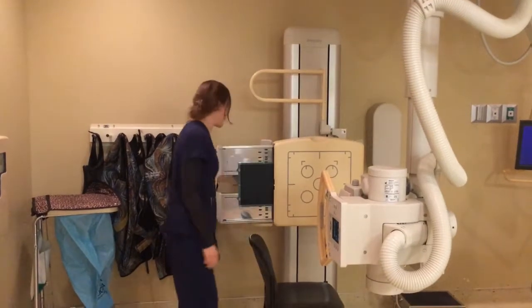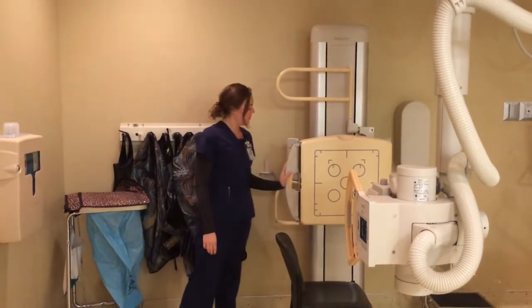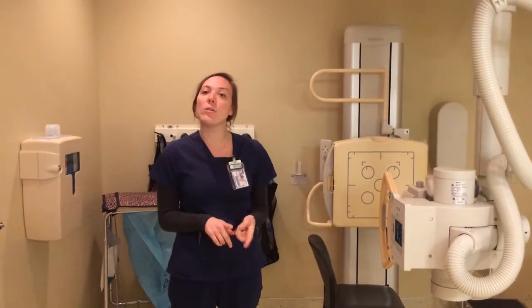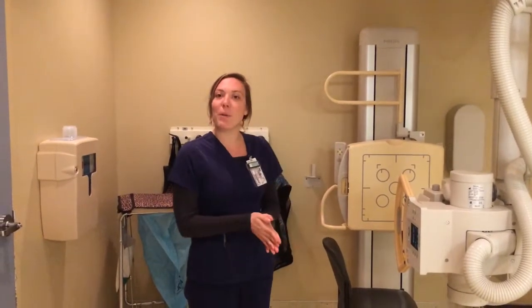We're going to be using a 10 by 12 in the wall bucky in the landscape orientation. We're going to be doing 4 projections today: the lateral, the Townes, the Caldwell, and the SMV. So now that our room is set up, we can go ahead and grab our patient.